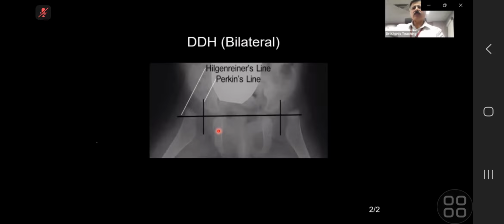And there is a range between about 4 months till about 7 months. So here you can see this one, but barely, you can have a debate if this is visible or not. But actually, you can infer where it will be because this is the neck. So you can infer that it is sitting there.